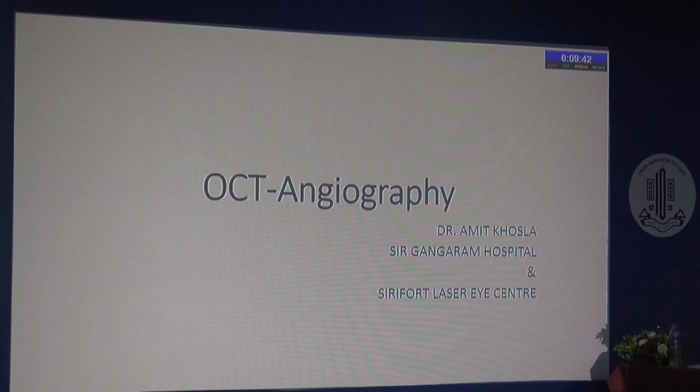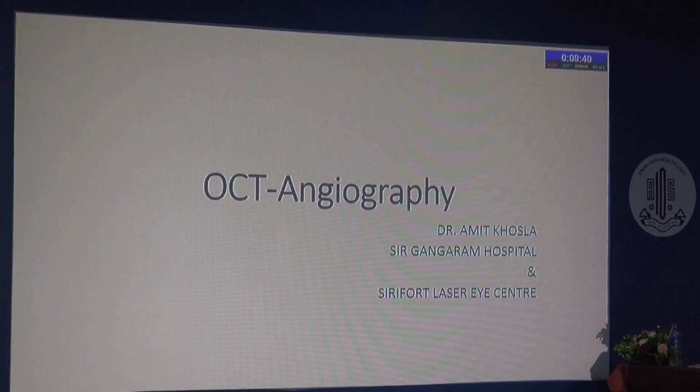Number 2 is what is the vitreomacular interface? Can you see a membrane or not? Number 3 is the thickness. You may have a normal contour, but you may have thickening or thinning. Number 4 is the IS-OS junction, which Dr. Jha showed, the small one. If that is injured, then you have damage to the retina. It's not good. So for all unexplained visual losses, what we recommend is fields and an OCT to pick up any vision loss.